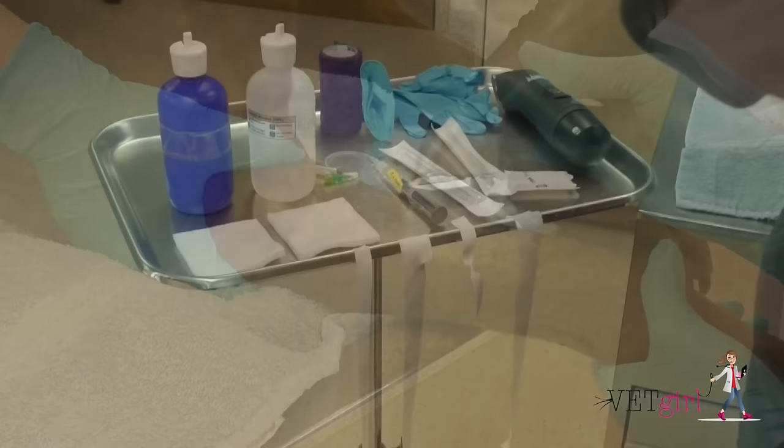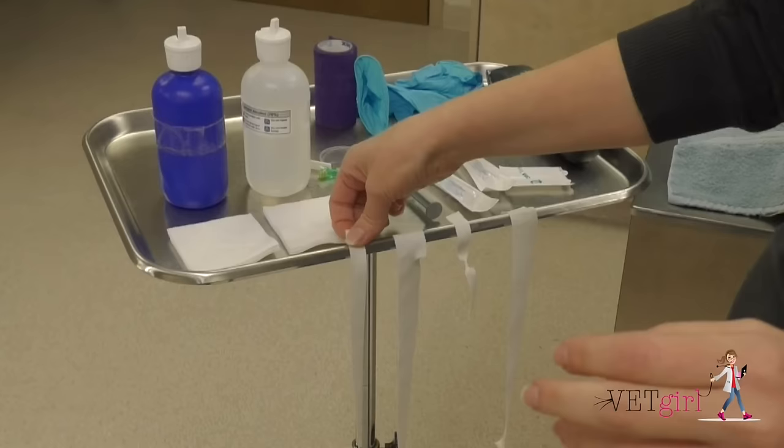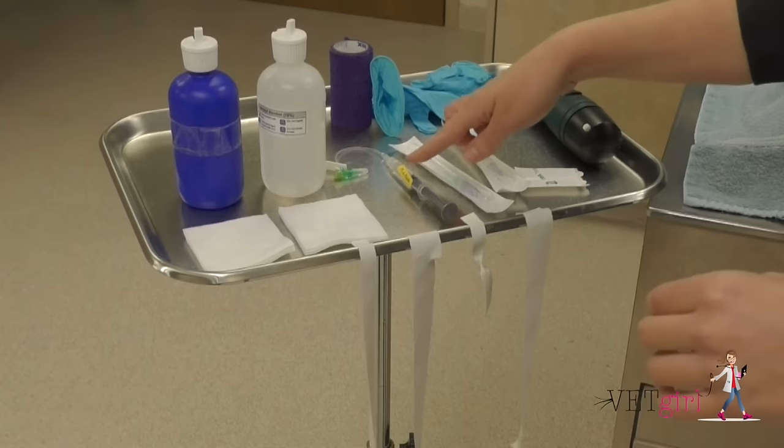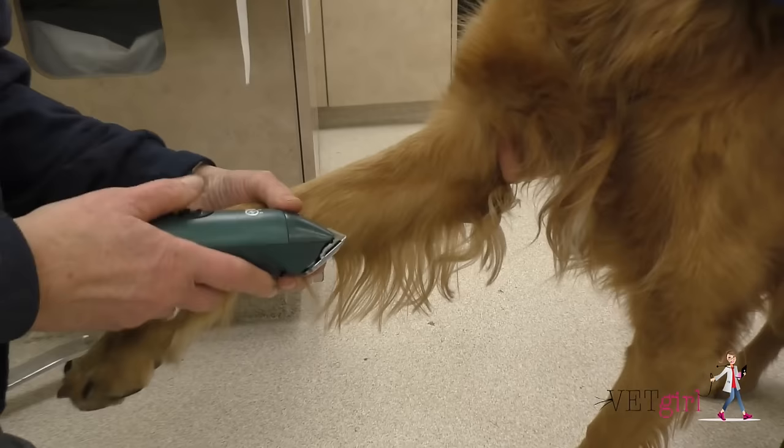To start, make sure to be well prepared and have all the supplies necessary in place, such as clippers, scrub, a restrainer, white tape ripped into appropriate sizes, tegaderm, multiple catheter sizes, a T-port that has already been flushed with saline, an injection port, etc.